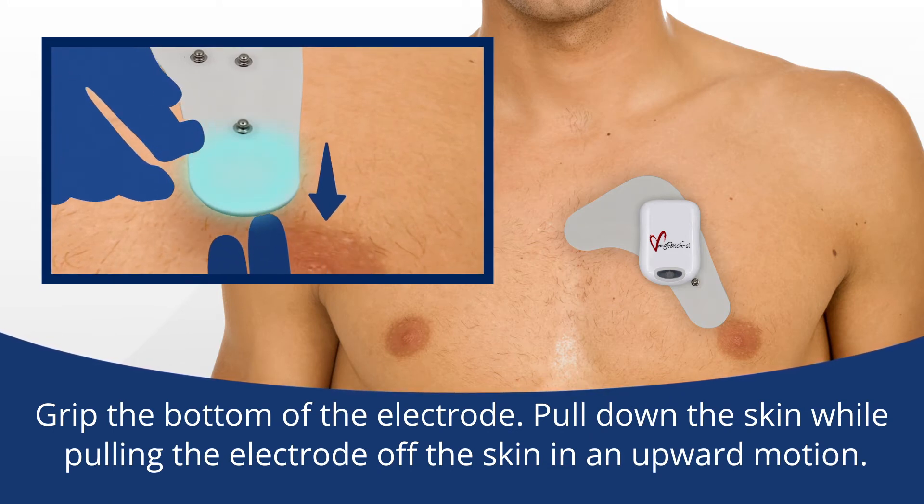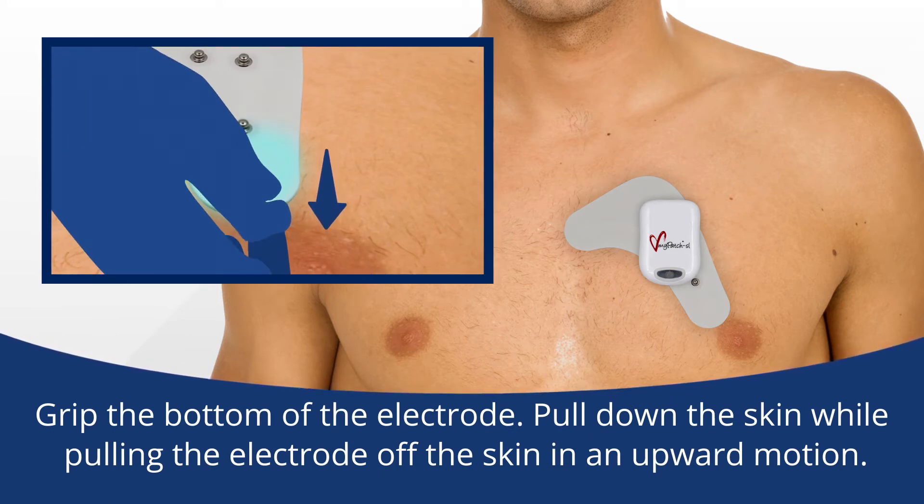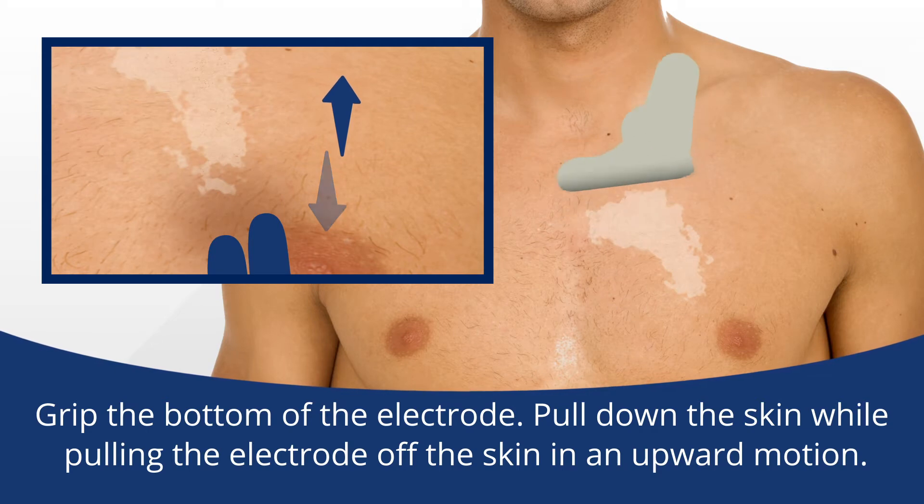grip the bottom of the electrode. Pull down the skin while pulling the electrode off the skin in an upward motion.